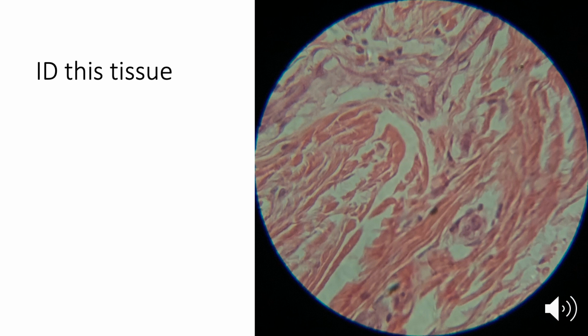All right, next tissue type. Let's take a look. I do have some empty spaces here, but if I look at where my cells are, they're here and here, over here, over here. The cells seem to be pretty spread out, so it must be some sort of a connective tissue. Next question is, do I have lacunae? And if I look at those cells, I can see that there's really not any pockets or bubbles around most of those cells. Okay, so it's not a cartilage. It's a connective tissue, but not a cartilage.